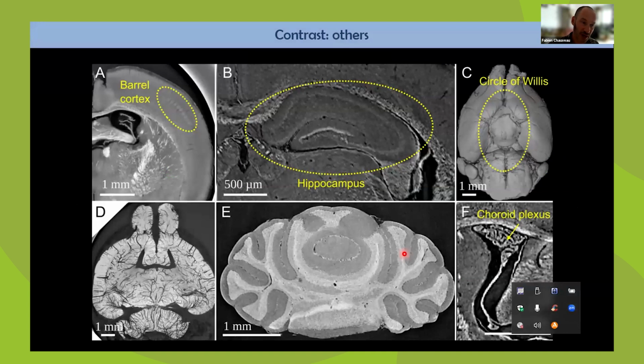Just a few more slides to conclude, if I have more time. I focused on two scientific cases, myelin and amyloid pathology, but there are a lot of interesting observations that you can make even on the mouse brain. For example, in some animals we are able to see subregions in the cortex. The contrast in the hippocampus is really intriguing.